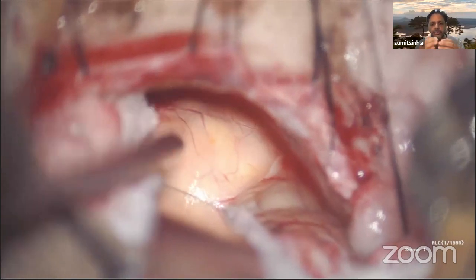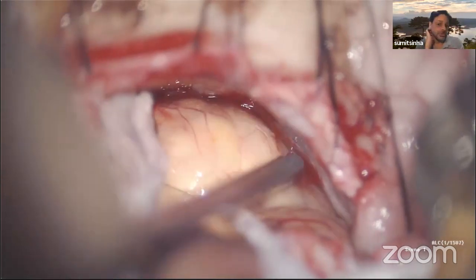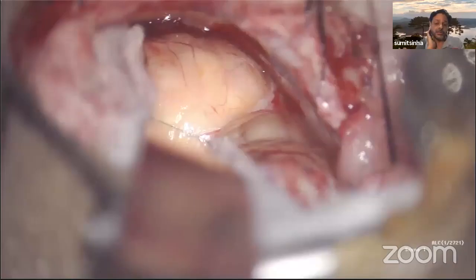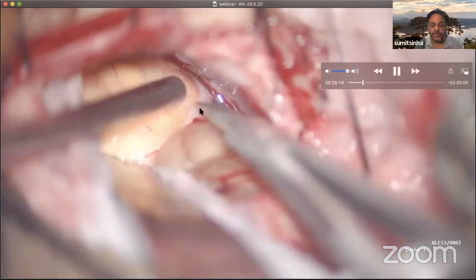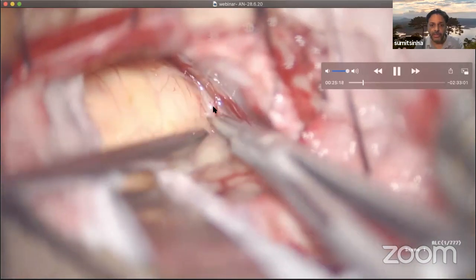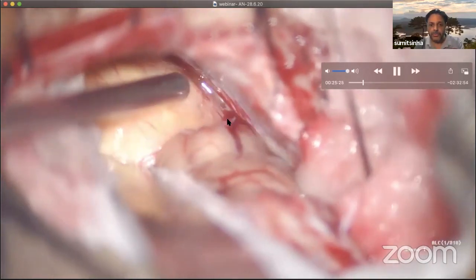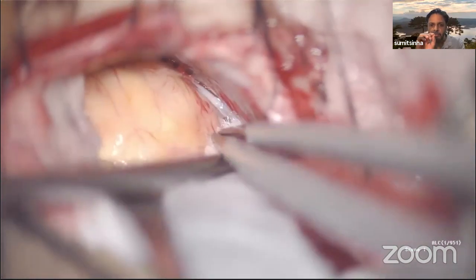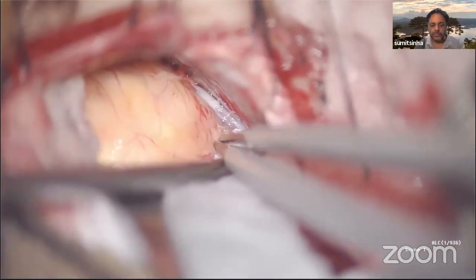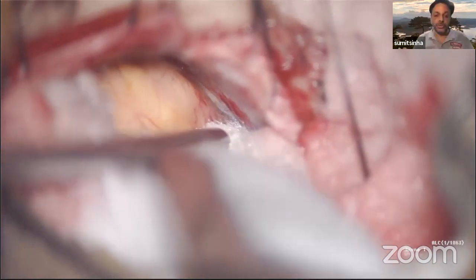Now, once you reflect the arachnoid membrane from over the tumor capsule, then you see a yellowish colored tumor capsule devoid of any arachnoid membrane, and you are ready to do the second part, the decompression of the tumor tissue. You see that these are some of the arachnoid membranes that are still there, and I am doing sharp dissection over here in order to cut these arachnoid membranes and slip them slowly, gently from over the tumor capsule. If at all any cautery is required, then you have to use that cautery at very, very low settings and only momentarily, as part of touching and going. So that is all that you require, if you are at any time compelled to use the bipolar cautery.